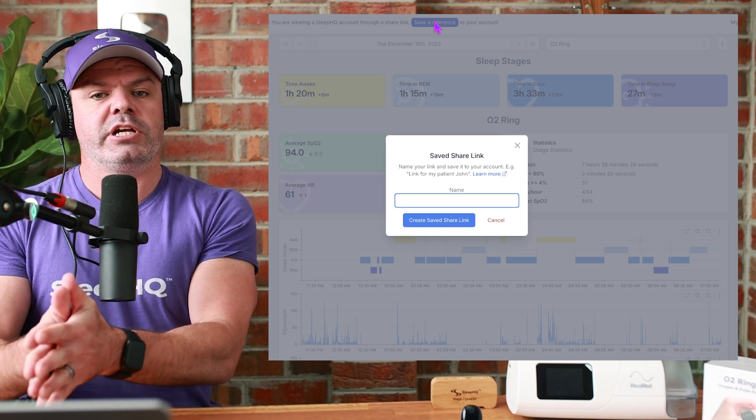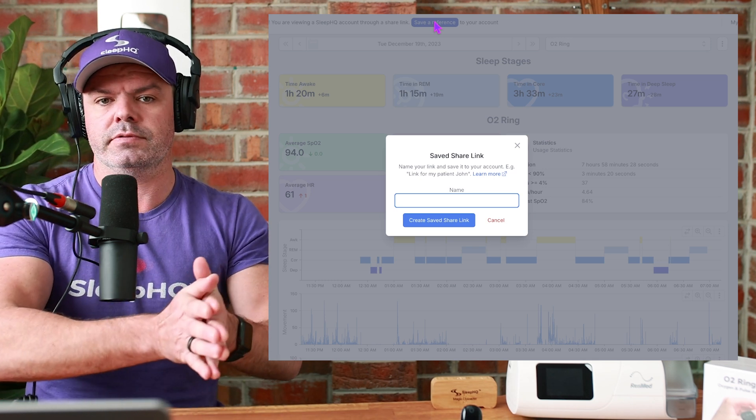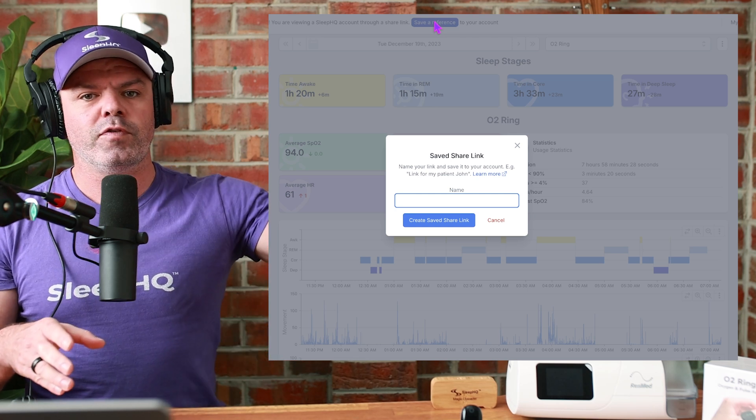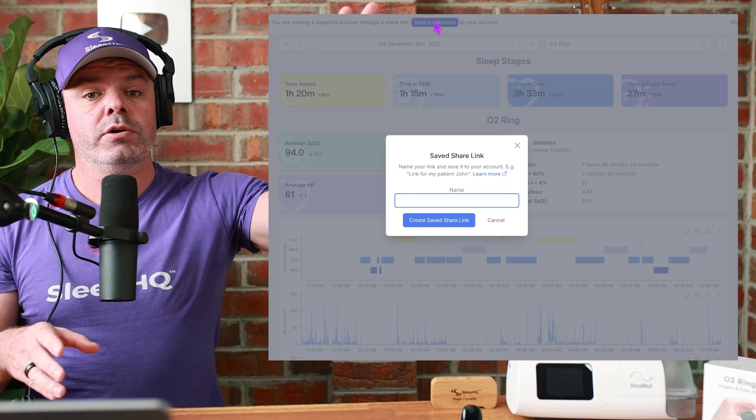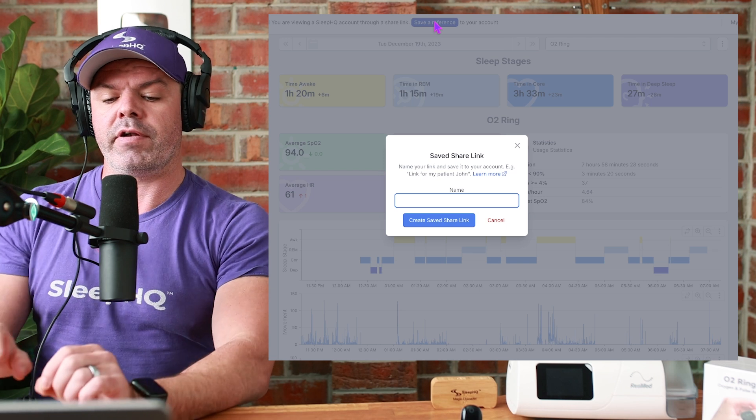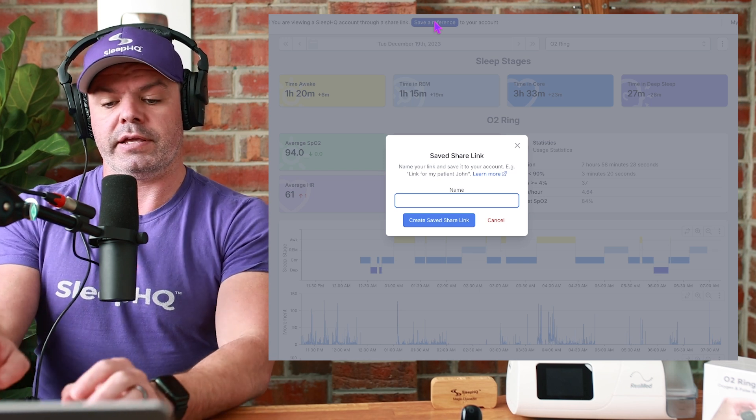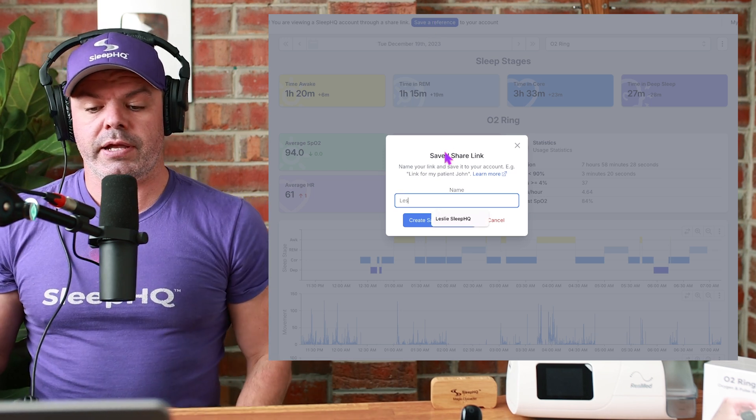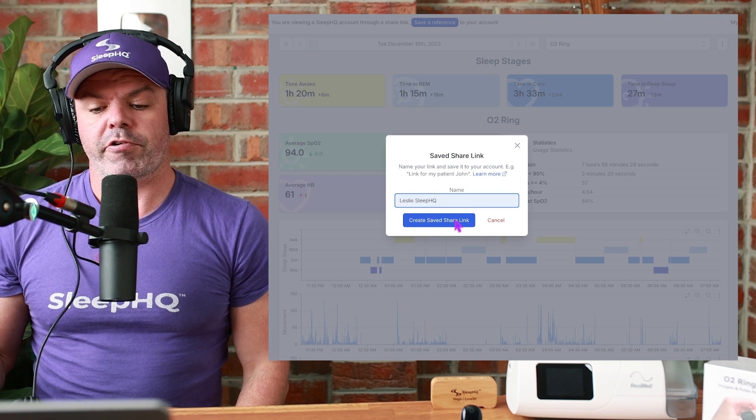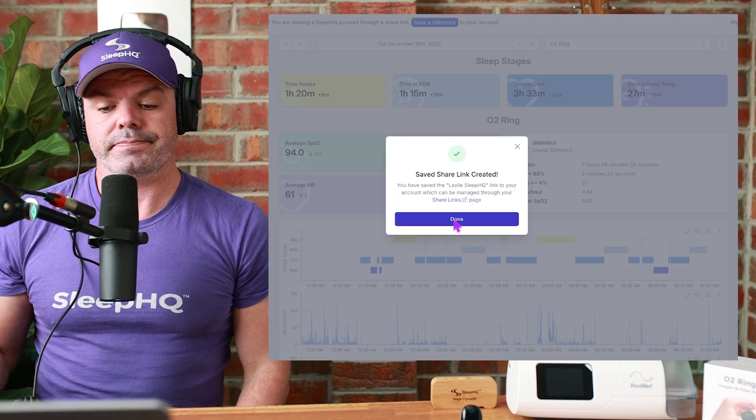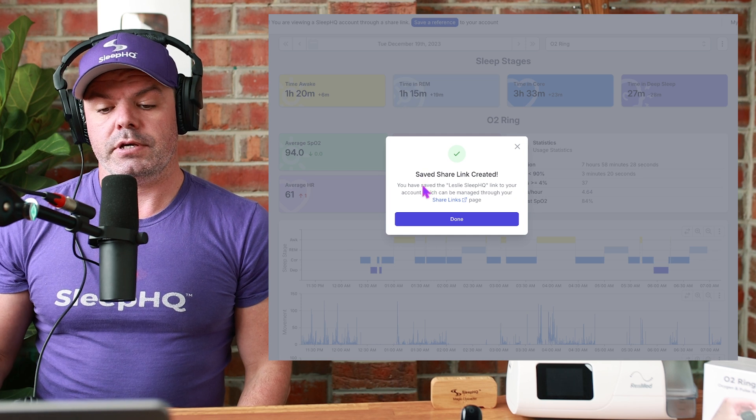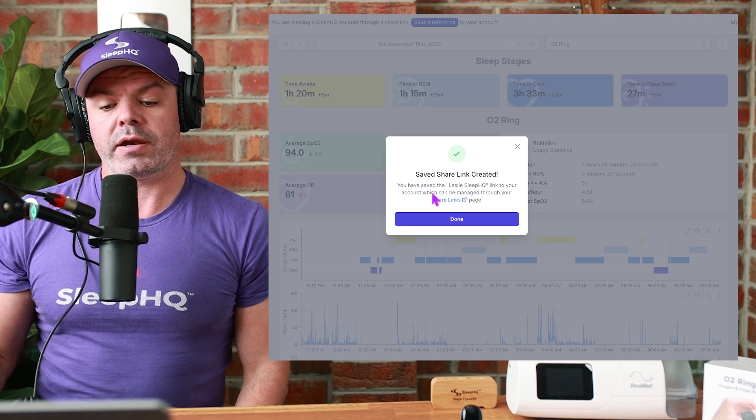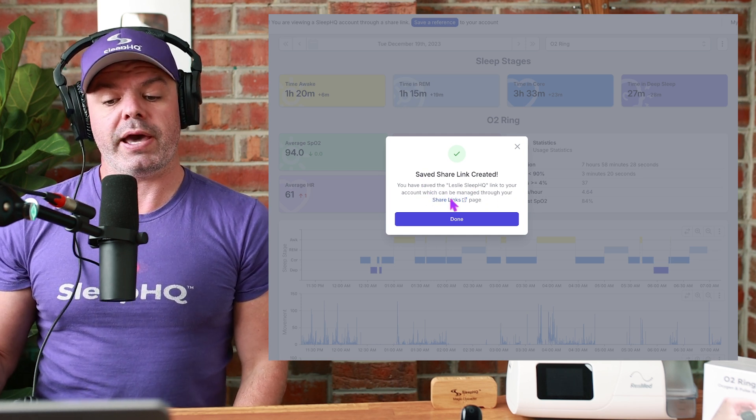And that will save that share link to Stuart's account for future reference. So instead of hunting through the forum, trying to find where Leslie's post is, he can go into his Sleep HQ account. I'll show you that now and find the link. So we'll call it Leslie Sleep HQ. Create saved share link. There we go. You have saved the Leslie Sleep HQ link to your account, which can be managed through the share links page. So we can click the share links page.